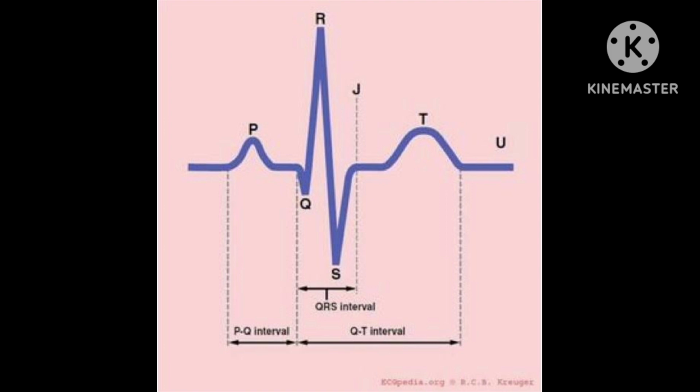The current flows in a certain pattern. The main role here is of the electrodes only. Electrodes pick up the current and transmit it to an amplifier inside the electrocardiograph. Then the electrocardiograph amplifies the current and records it on a paper as a wave line.